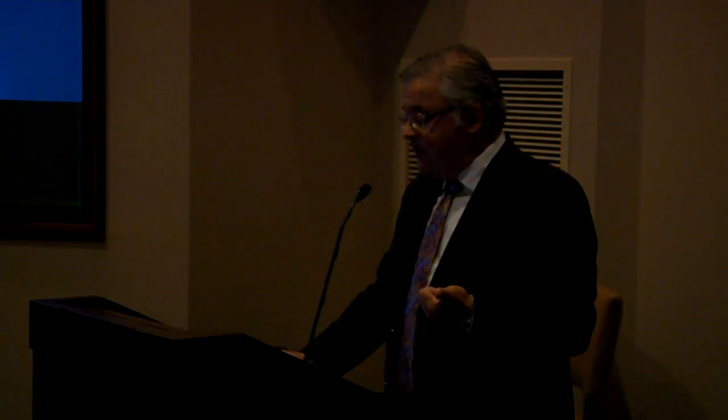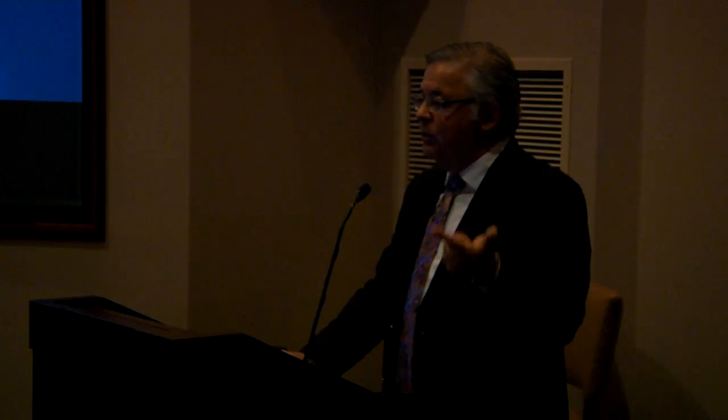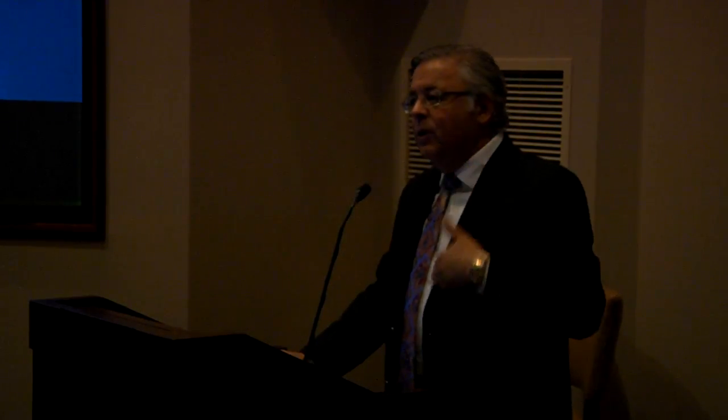It's a motion scan. And what's important is that the degree to which we see this diffusion, which is clinically significant, is driven by a few factors. You have to have an intact cell membrane. You have to have active transport mechanisms within those cell membranes that are working. And the key circulation, which Dr. Sugarbaker alluded to in his discussion of chemotherapy efficacies, you have to have an intact microcirculation. Whenever you have interruptions in any of those things, then you will have changes in diffusion from baseline, most commonly after the effects of chemotherapy.